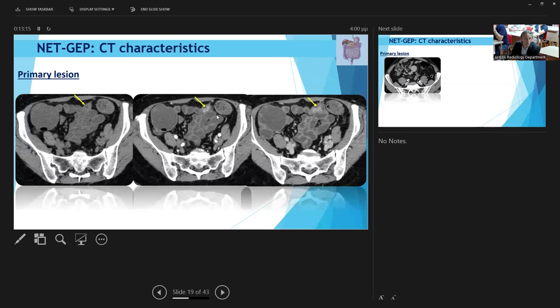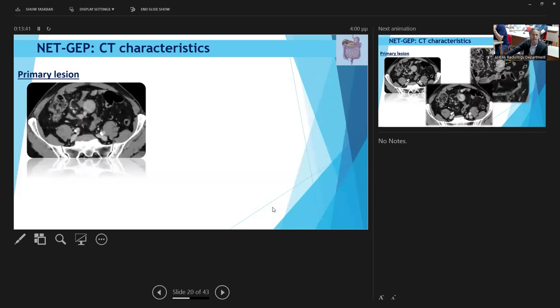This is one of our most challenging cases, in which the lesion is a flattened lesion characterized by focal ulceration. In this case, if we do not perform the dilation of the small bowel, it's quite impossible to make the correct diagnosis. So please, I suggest you dilate the small bowel in all cases suspected for neuroendocrine tumor.